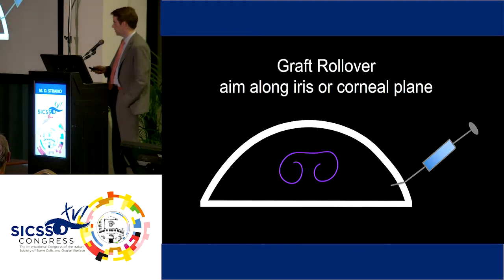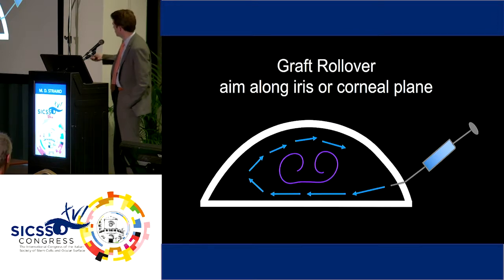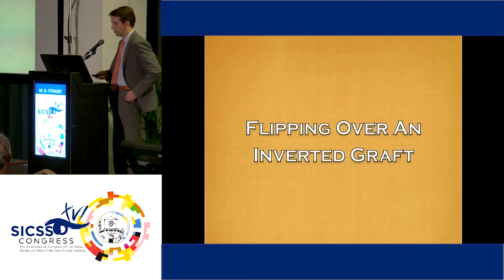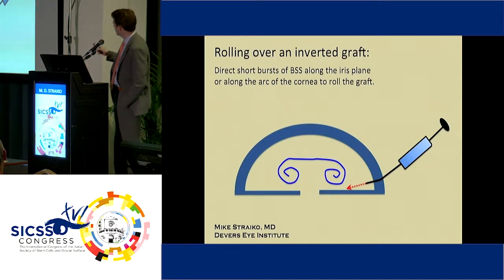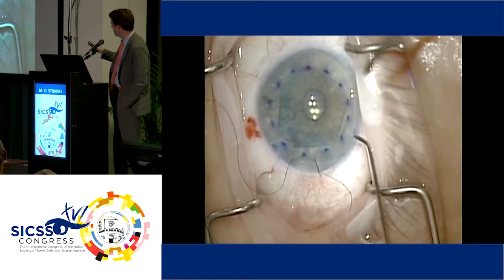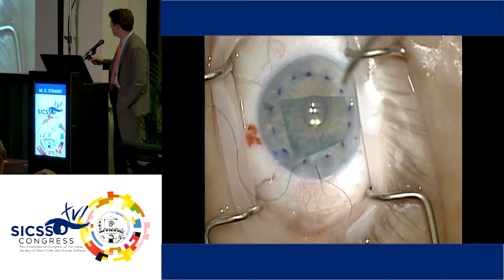So sometimes the graft is upside down and you need to roll it over. The idea here is to inject not straight at the graft because that'll just jam it into the anterior chamber angle. Aim along the iris or corneal plane to create a circular fluid to fold the graft over. And you want the anterior chamber deeper when you do that, not overly shallow. And here's another video showing the same idea.